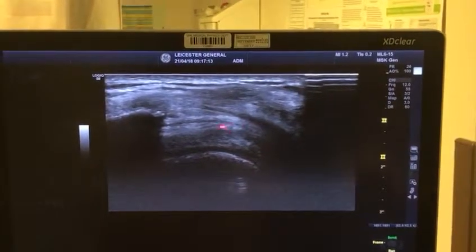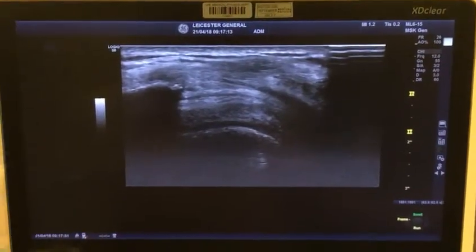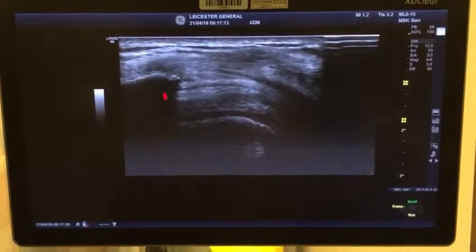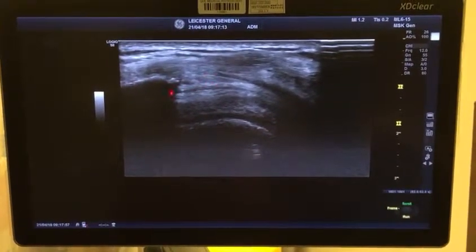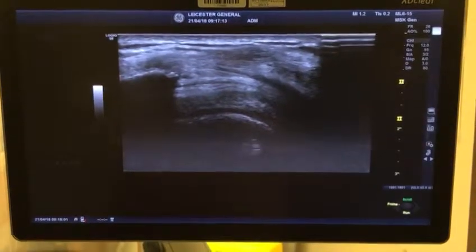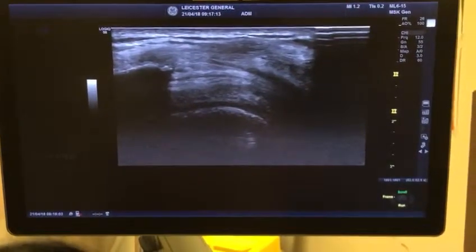To do the injection, you come from distal to proximal — you put the needle like that and bring it in. You do a hydrolocation for injecting. That's your acromion, and this is a very classic appearance — the bird beak appearance of the supraspinatus tendon.